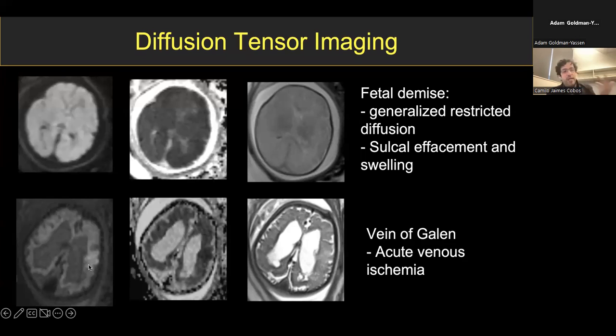And this has proven very useful, and we worked on this with Darren Orbach, our neurointerventionalist, because what we've seen, and we published our experience, is that the high volume of shunting and venous hypertension that results from vein of Galen malformations can actually reach a threshold. And this is known from postnatal cases. If they start developing the melting brain syndrome, that's a really bad sign.